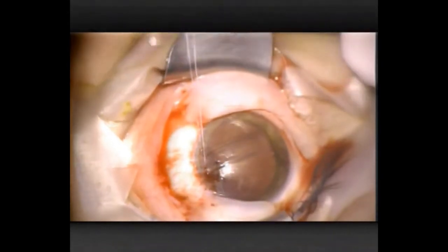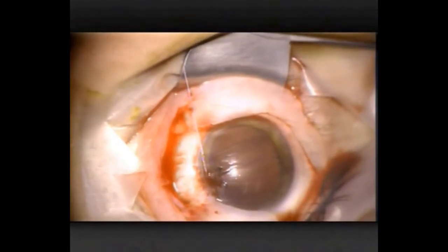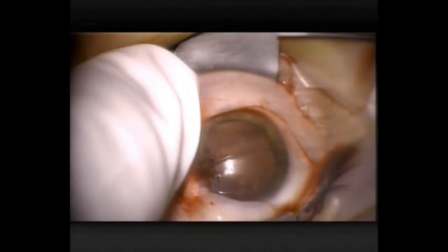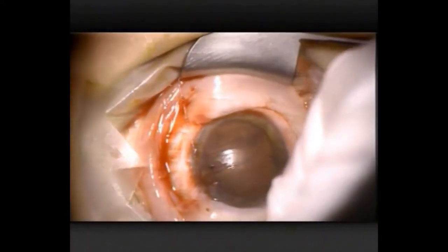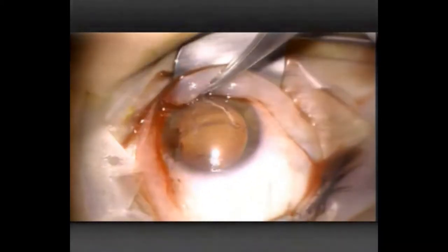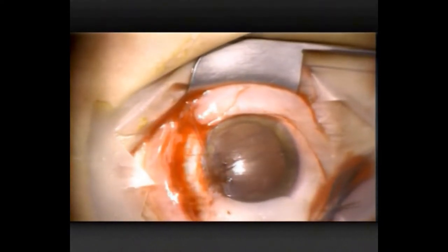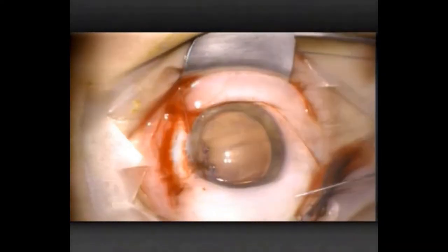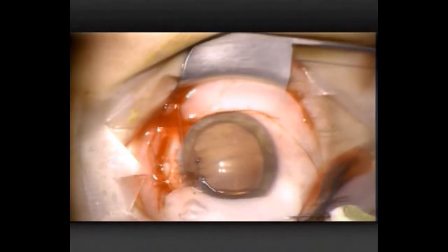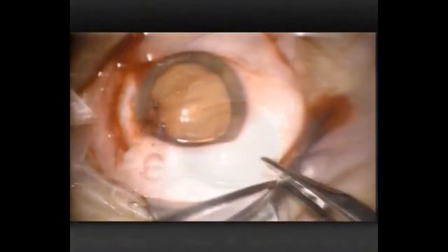Now I'm distracting the eye inferiorly — infraducting it with the stay suture — as I'm preparing to harvest the conjunctival graft. Again injecting some local anaesthetic sub-conjunctivally, a bit of topical anaesthesia, and now following up with some sub-conjunctival air injection. This pneumo dissection Alex Poon taught me, and I've found it very useful for dissecting conjunctiva away from Tenon's.